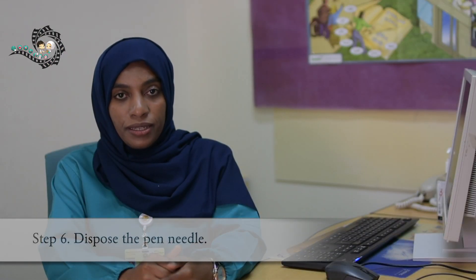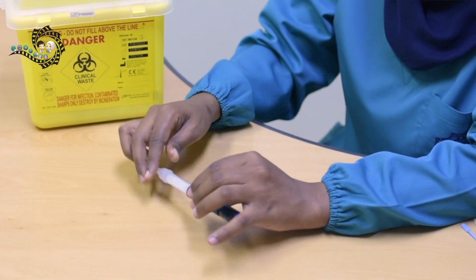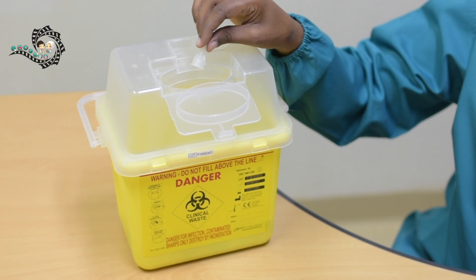Dispose of the pen needle. To discard the pen needle, scoop the outer cap back onto the needle. Unscrew the needle and take it off, then discard it in a sharp container. Wash your hands and document in the patient file.